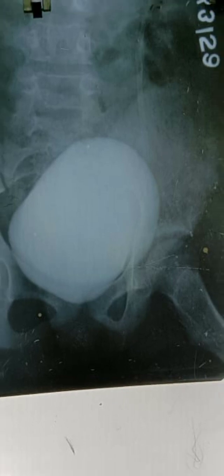Any radiograph of the kidney, ureter, bladder may come across the pelvis of the ureter. The pelvis of the ureter is called pyelo. So the radiograph dealing with this kind of system, that is kidney, ureter and bladder, will be called a pyelogram. So that is the reason why it's called an ascending pyelogram.